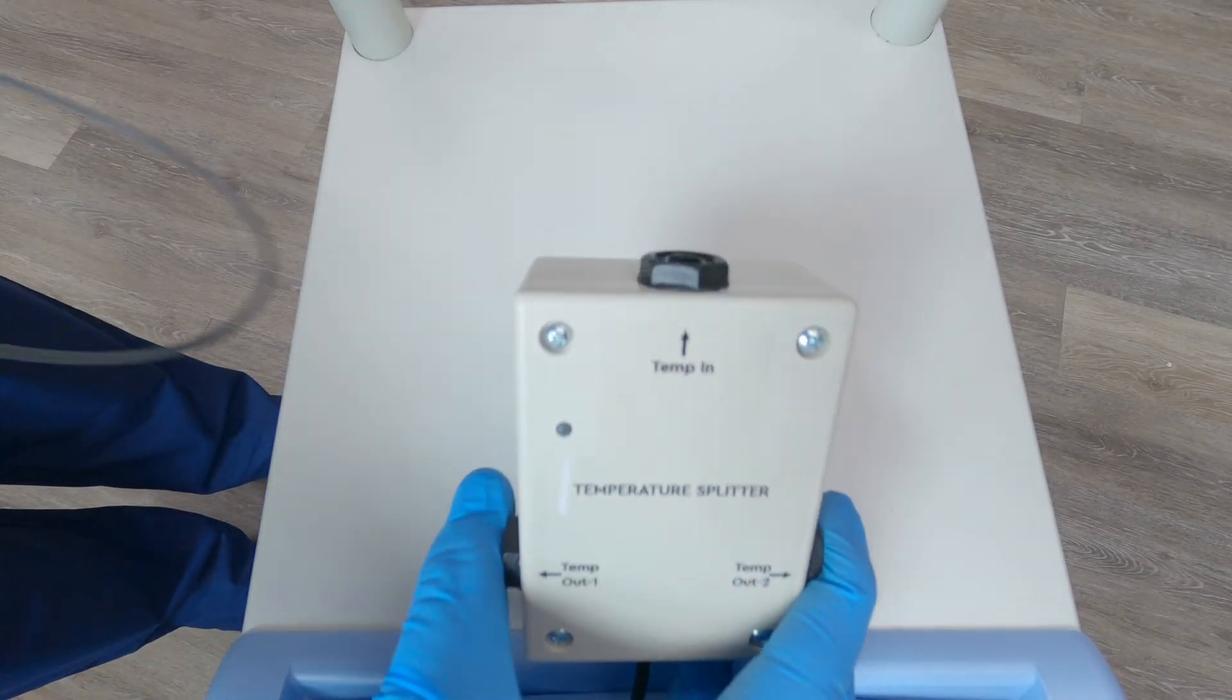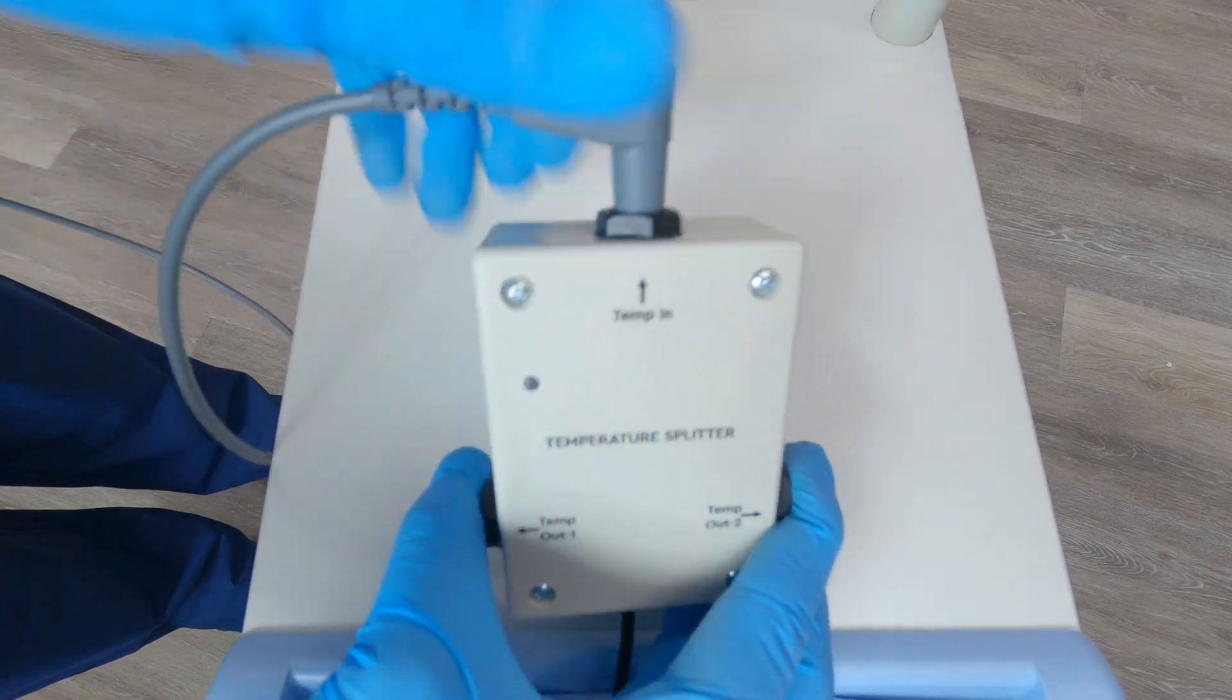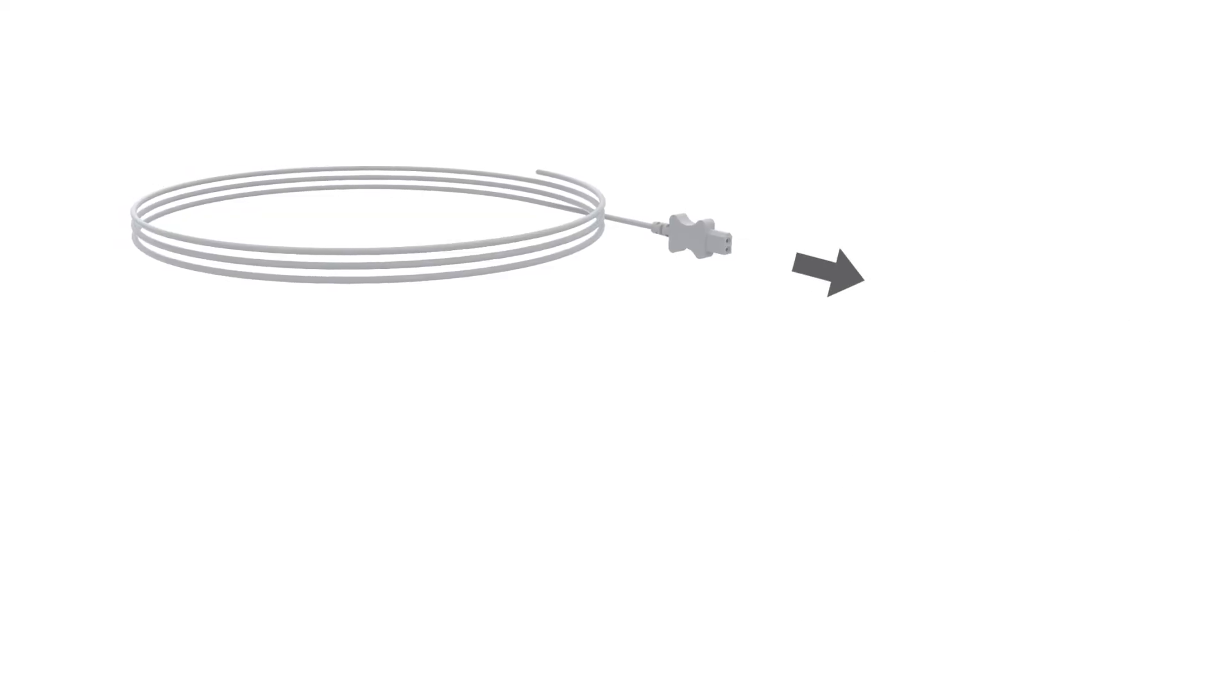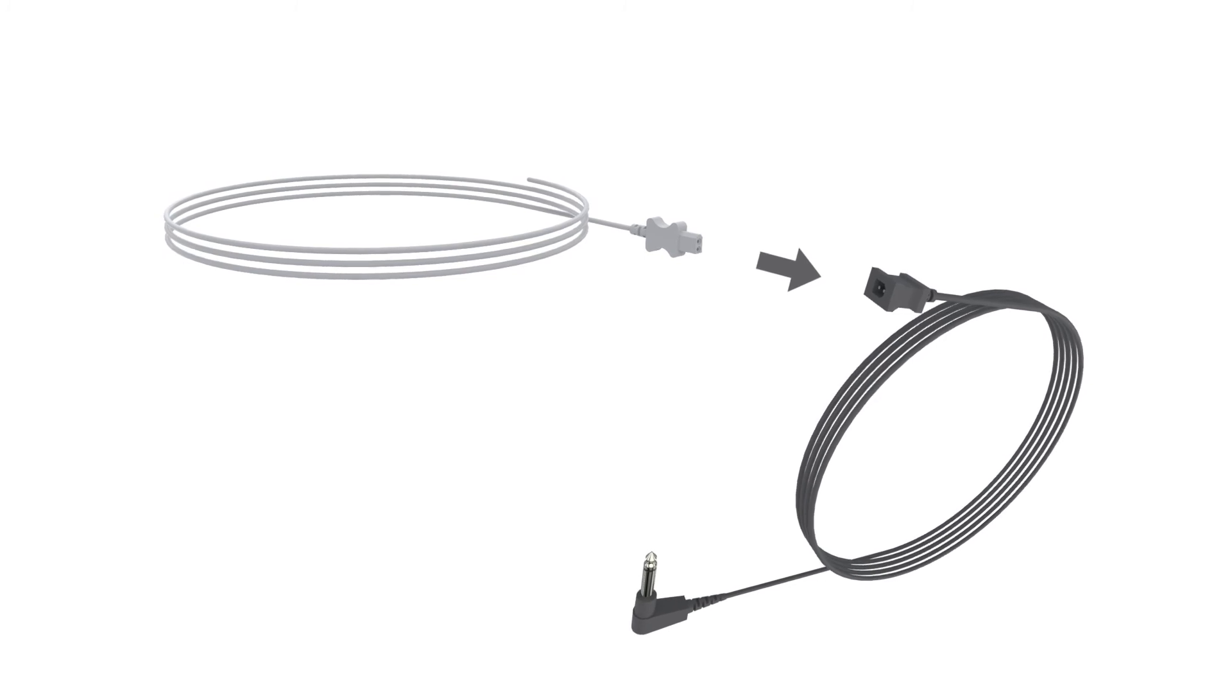First, connect a patient's core adapter cable to the temp-in input at the top. Now, connect the disposable core probe and insert the probe into your patient.